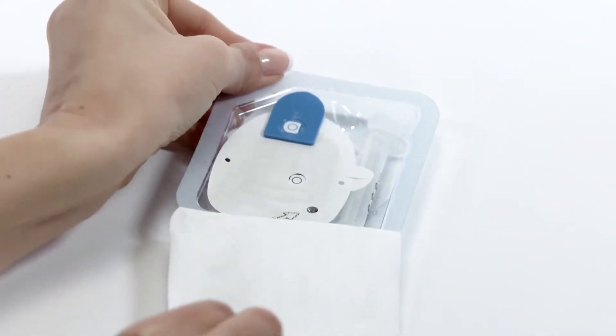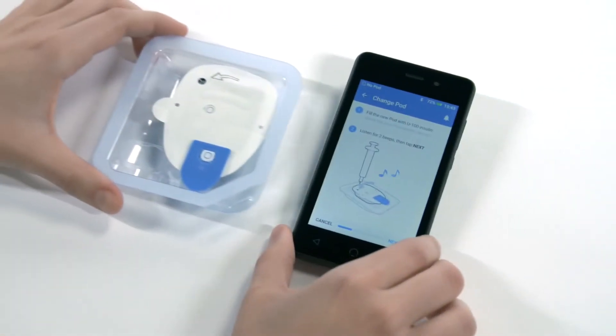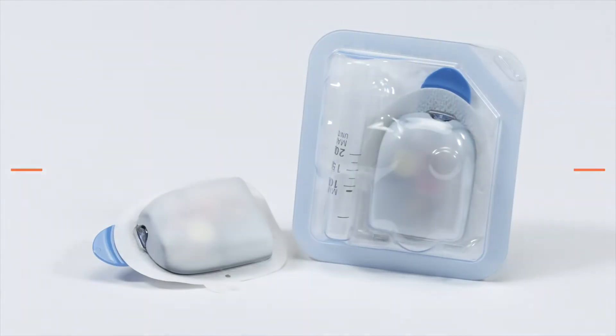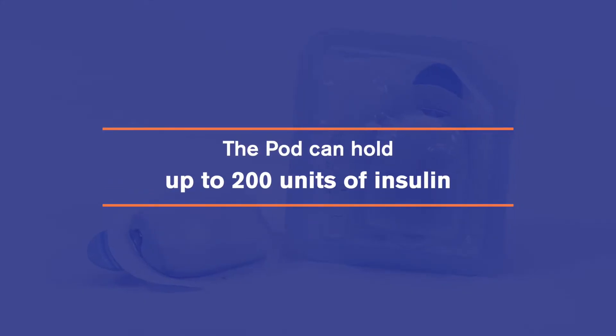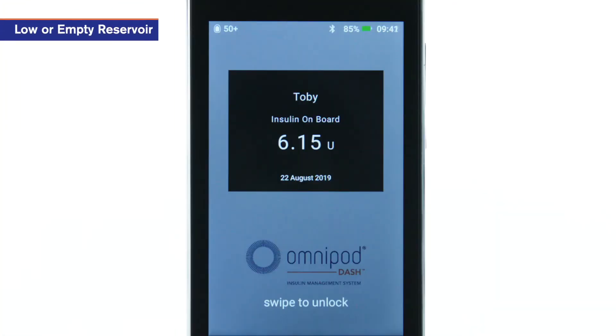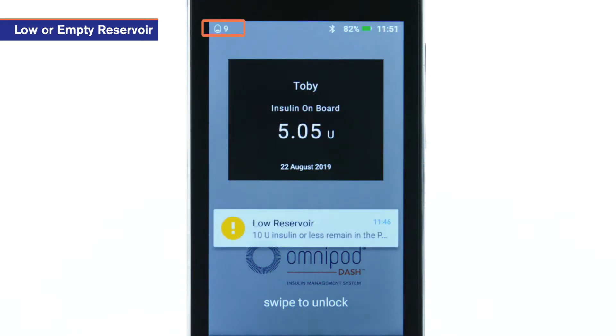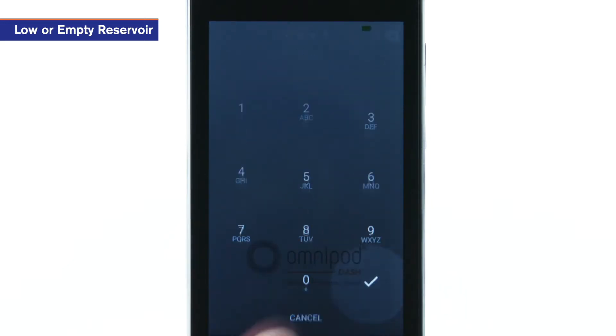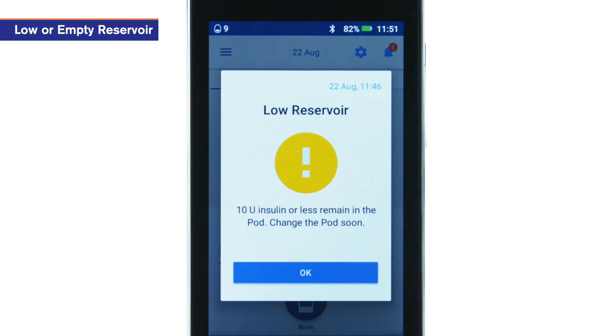A pod change is required for several reasons. First, a low or empty reservoir. The pod can hold up to 200 units of insulin. When the pod's reservoir contains less than 50 units of insulin, the icon on the status bar of the PDM changes to indicate the exact amount of insulin remaining. The PDM alerts you when the reservoir is low and suggests the pod change.